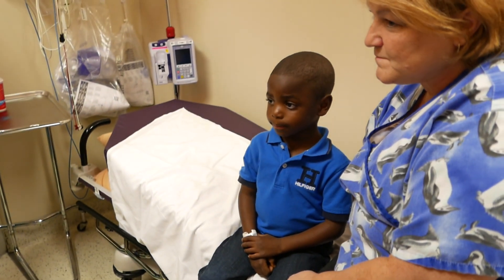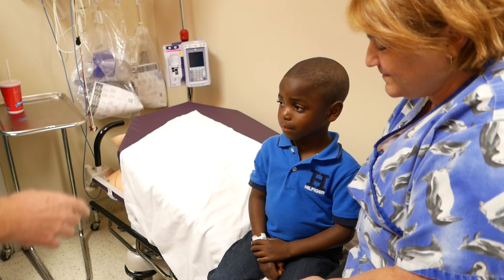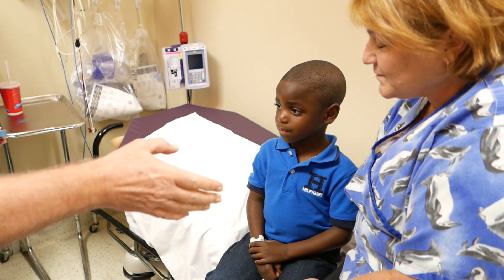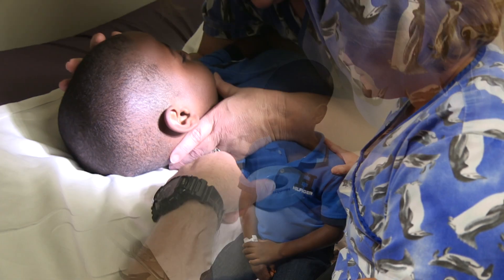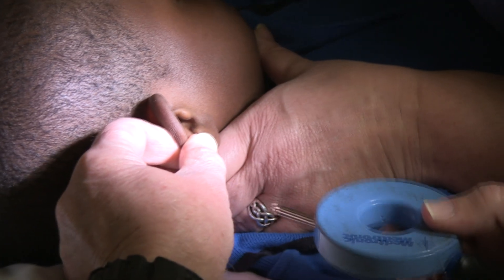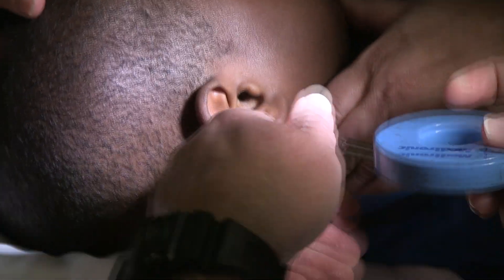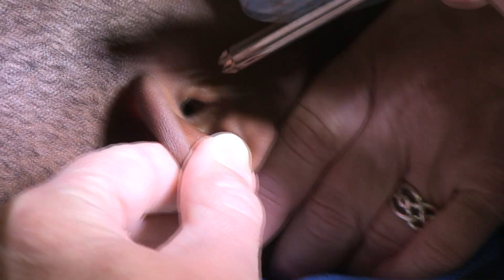If it works, I'm going to take credit. So what we're going to do — it's in his right ear. If you could lay him down and stabilize his arms — camera's rolling. Just keep yourself still. I can see the shininess. You can feel me touching your ear? Just be still, look at me.